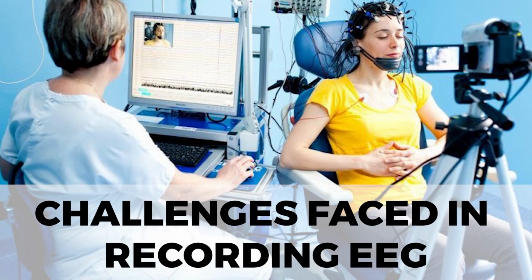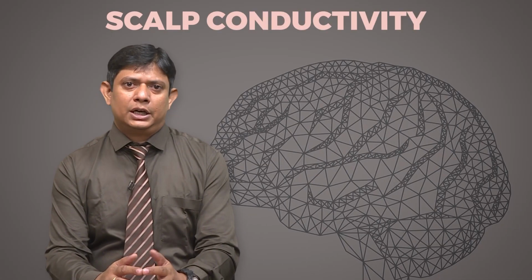Now, the challenges and considerations we face while recording EEG. First, scalp conductivity. The conductivity of the scalp, skull and brain tissues influences the propagation of the electrical signal. The skull acts as a barrier, distorting and attenuating the signal. Different tissues have different resistance, affecting the recorded signal quality.